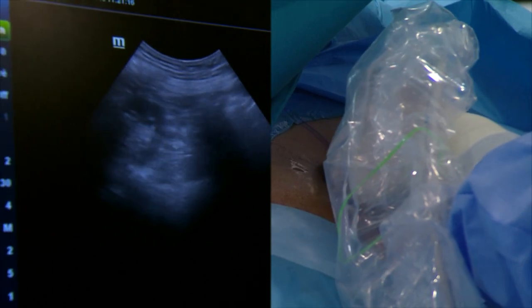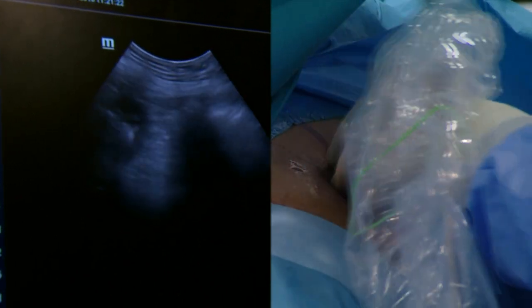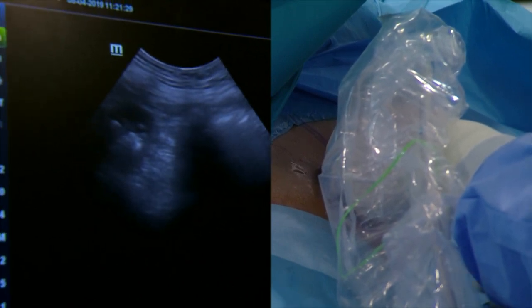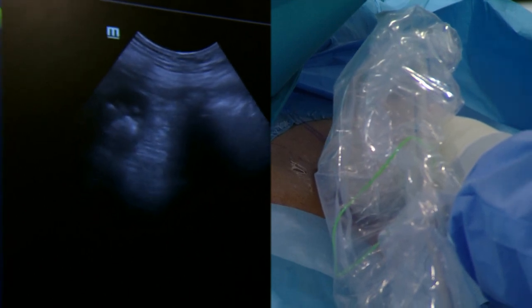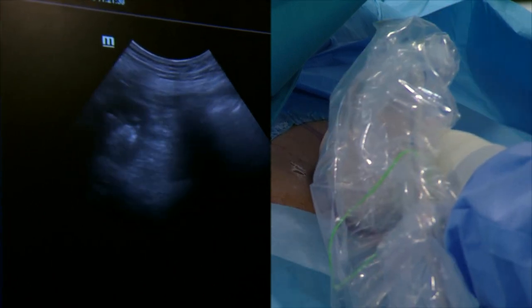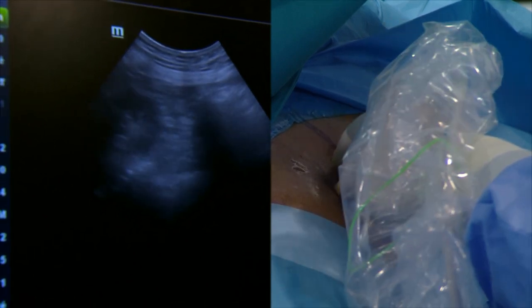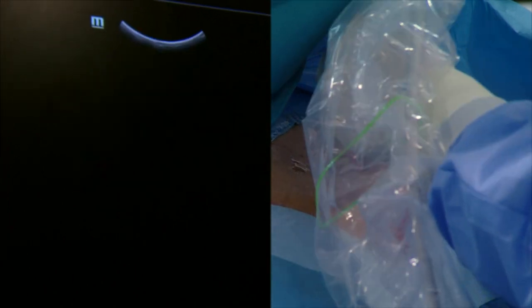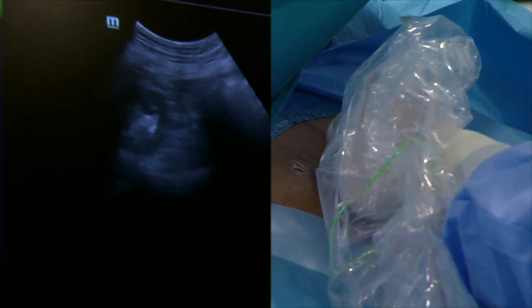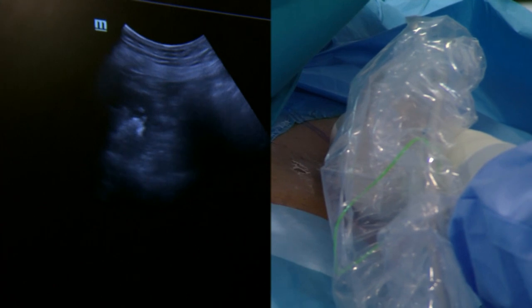You are pushing the parenchyma? We see the tissue moving. It's always a little difficult because you have not your own ultrasound available. This is a free-handed puncture, which is not so easy. But Zine told me that he has a difficult case.